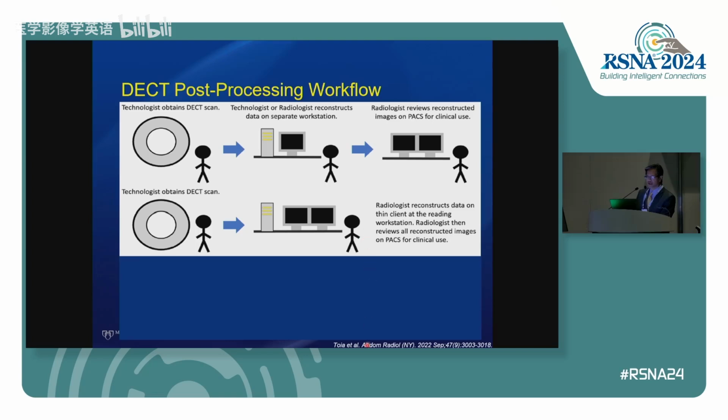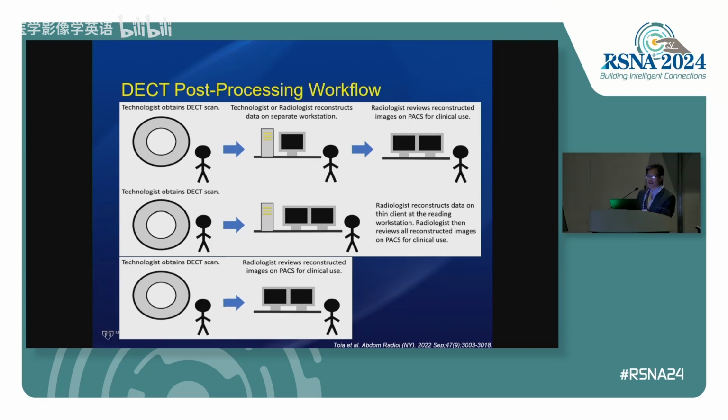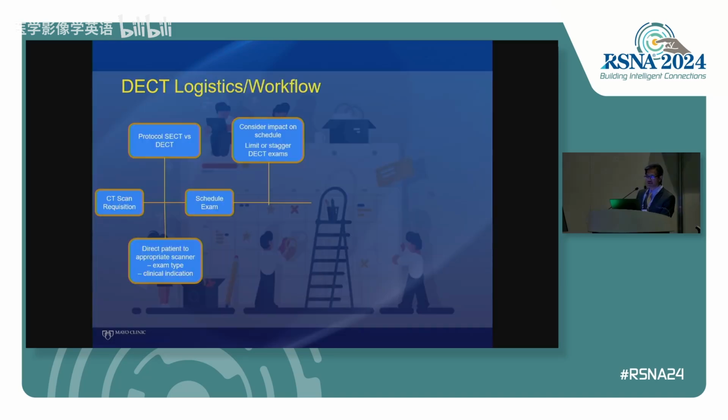So wouldn't it be great if we could just skip that middle step and have the scans sent directly, automatically post-processed, and then sent to the workstation? Well, that functionality is now available. So if that's not something that you're using in your dual CT workflow, then perhaps touch base with your vendor and see how you can incorporate that in your workflow.